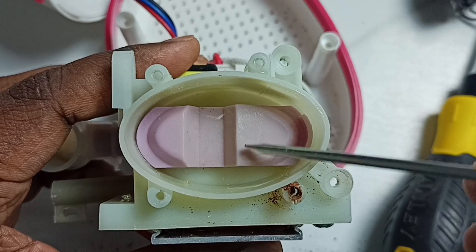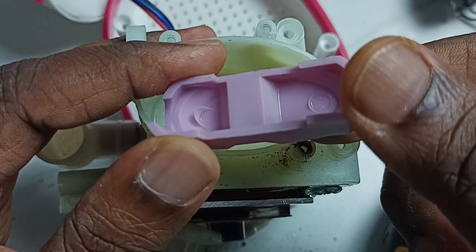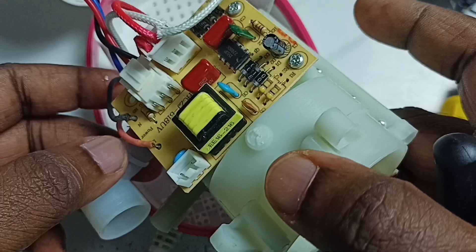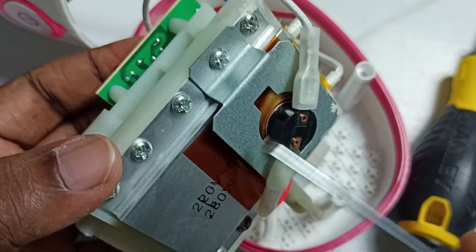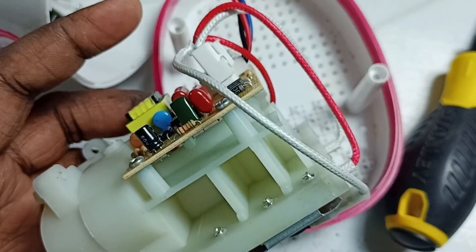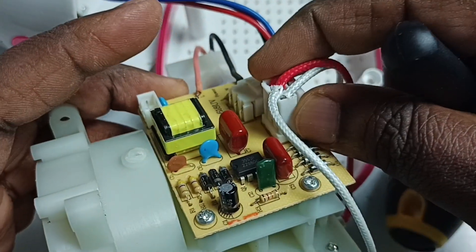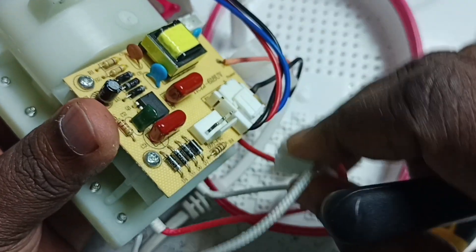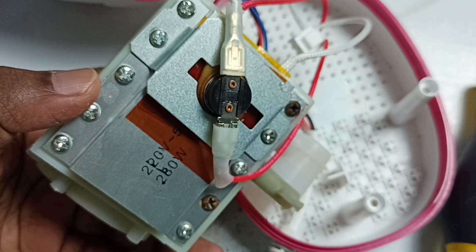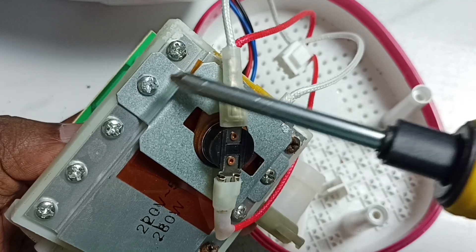We can take off this part as well. We can also take off this heating module and then this PCB. First I am going to disconnect this heating module from the PCB. Then we can remove this heating module — we have to remove all these screws. I am going to remove these two screws.